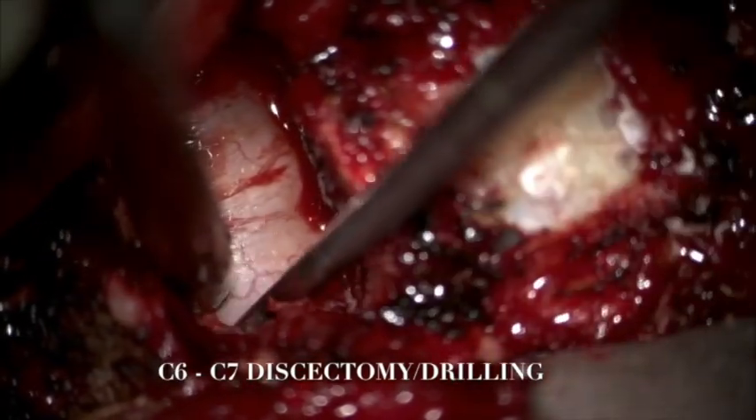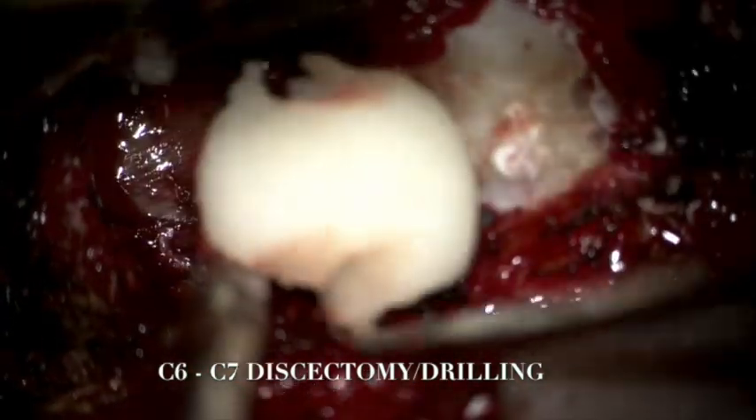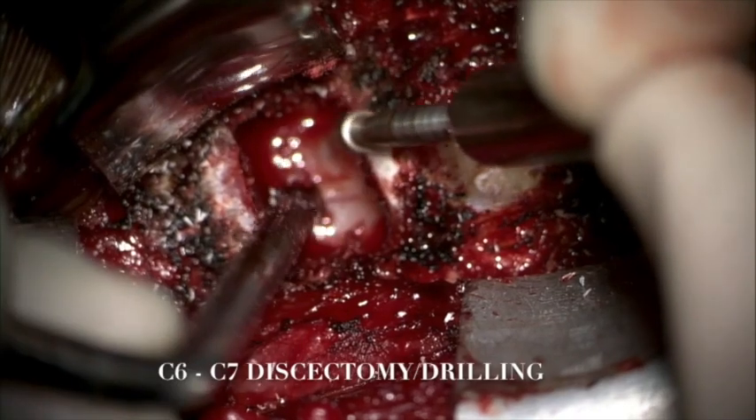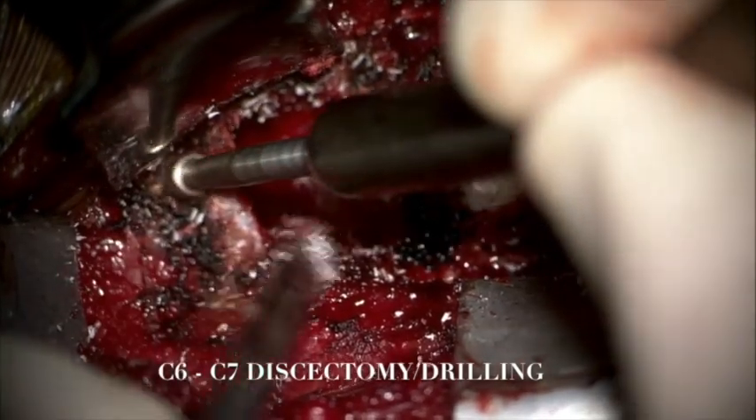We decompressed both nerve roots to the right and the left. Gel foam powder was used continuously for hemostasis. We simultaneously prepared and flattened the anterior surface of the vertebral bodies to appropriately accommodate the plate.